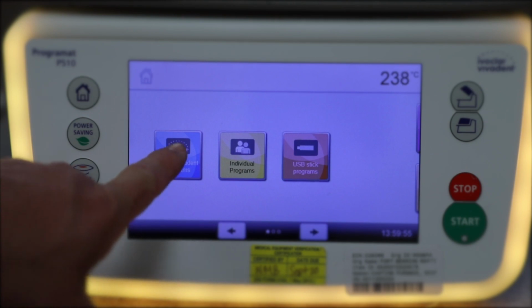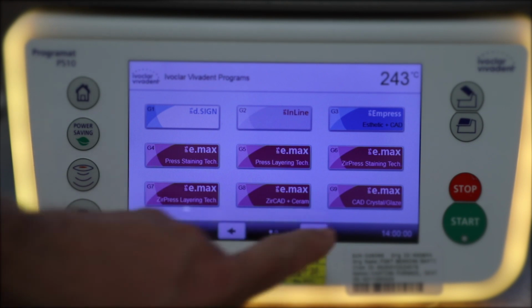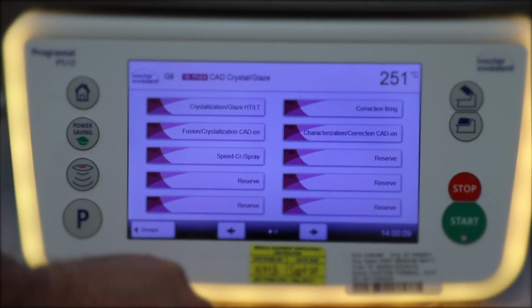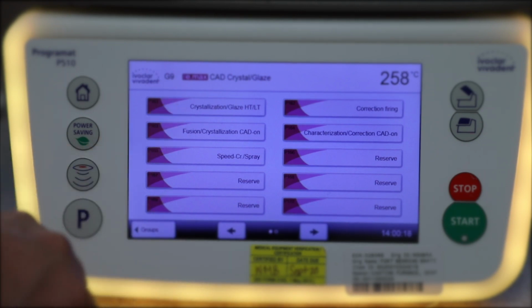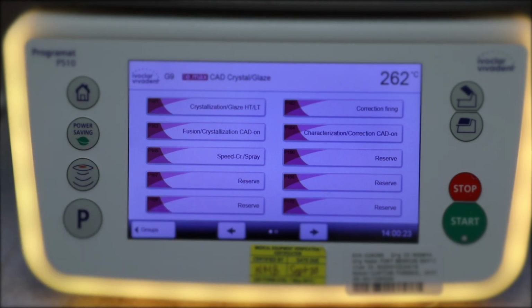All right, so if we take a look at the oven here, we're going to go ahead and select Ivoclar Vivadent Programs. We have a lot of options here. The one I normally use is in the lower right, this e.max CAD Crystal/Glaze. And within this menu, we see quite a few options as well. If we were going to put a paint-on glaze onto this crown, and crystallize that at the same time, I'd probably go with this top option here. Speed Fire is a great option if you're just going to crystallize the crown, or if you plan to crystallize and do a spray glaze.